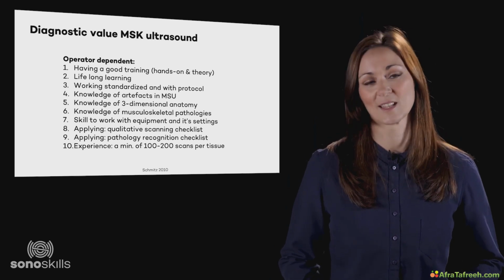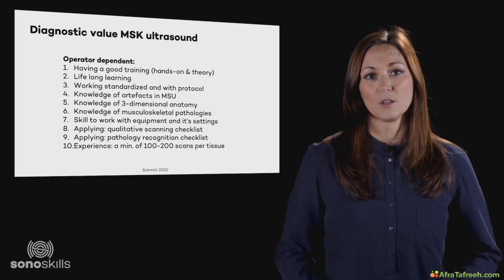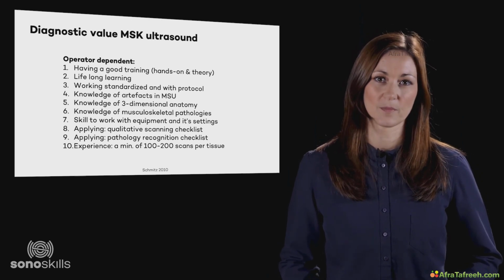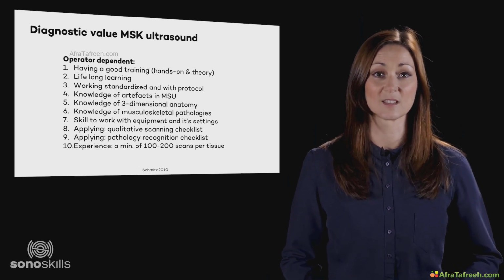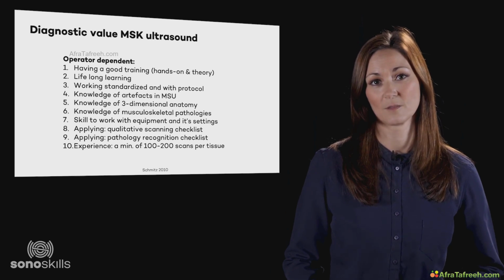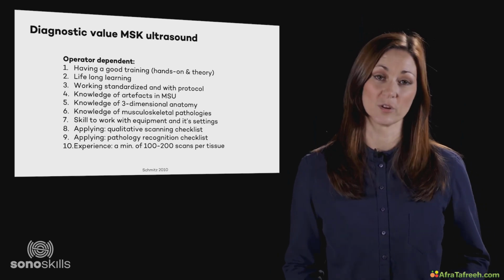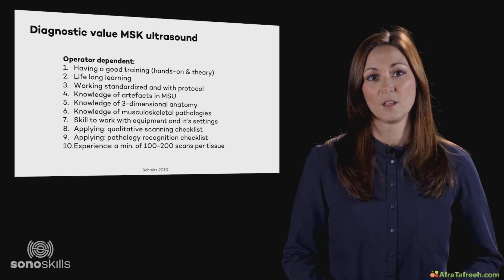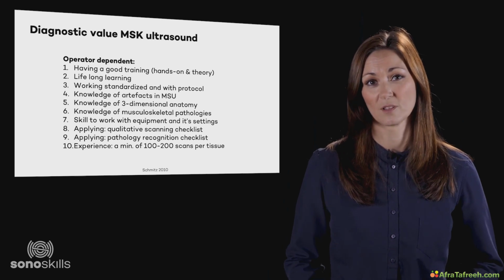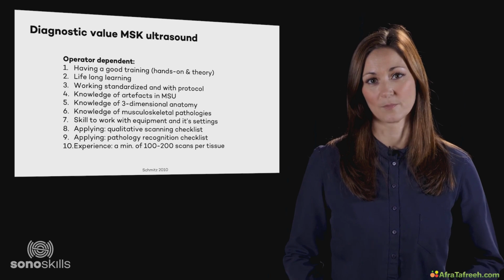Sonographers need to work in a standardised way and use existing protocols as a base to start scanning a certain joint. You will learn these protocols in the course. Using the protocols makes sure that you scan the absolute basics that is needed for a proper ultrasound assessment. In the next course levels, you will learn extra skills to become a more experienced sonographer. Knowing about artefacts is important. You will learn about these artefacts and their importance in another presentation.